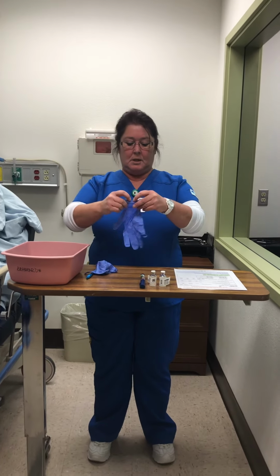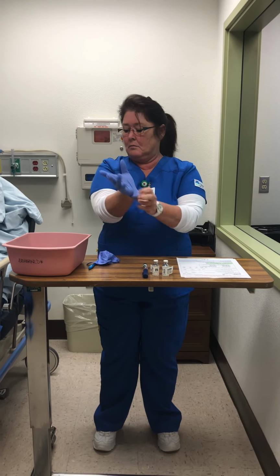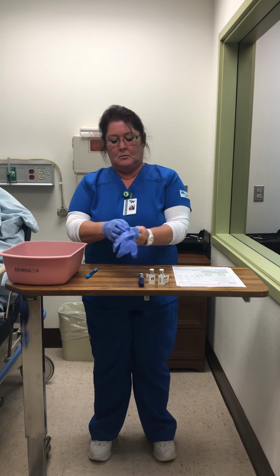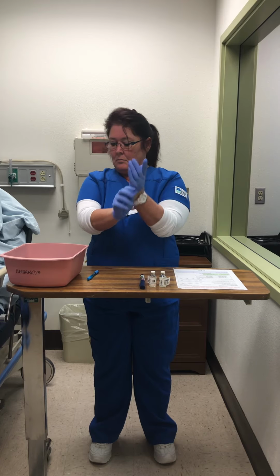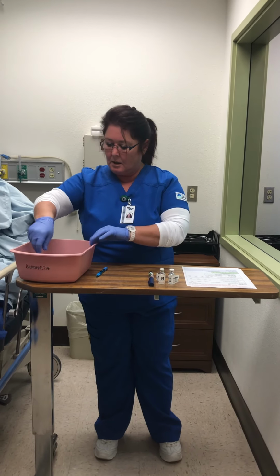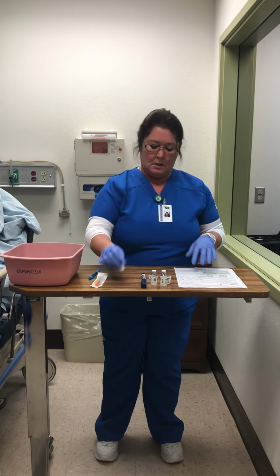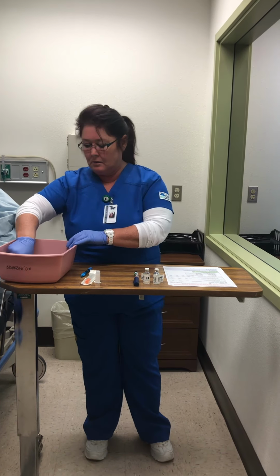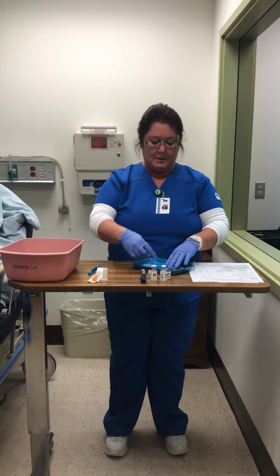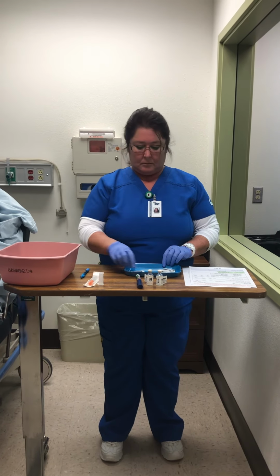I am going to don my gloves. And I am going to get my insulin needle and my insulin pen needle. I've got my tray, and I've got my alcohol wipes, and I have my label.